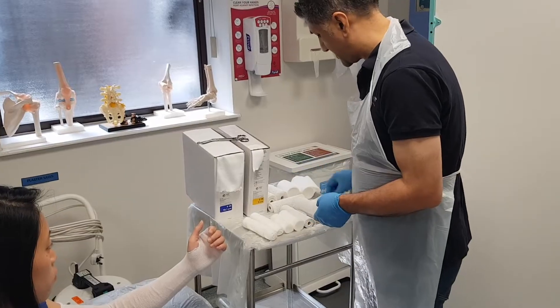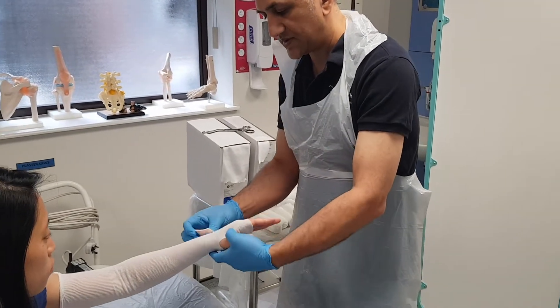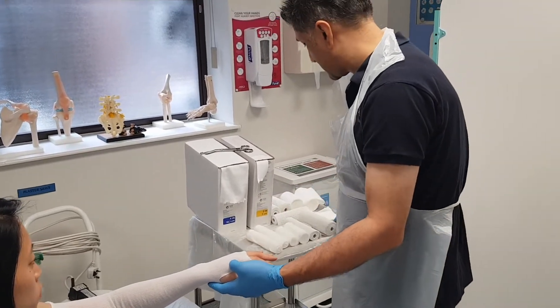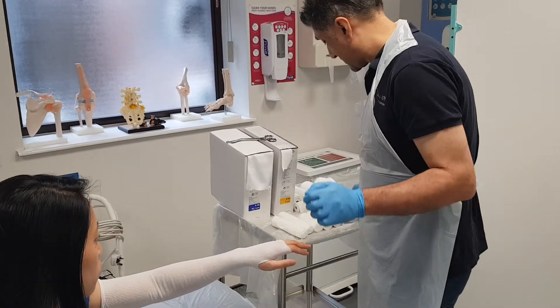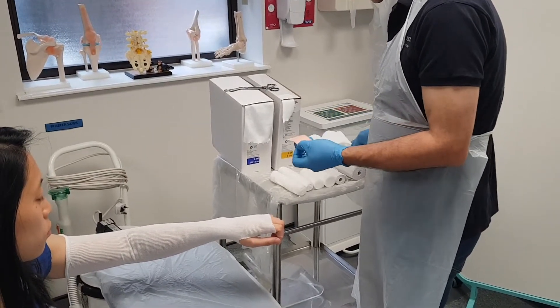Next we're going to apply some felt. We could put the felt over the styloid like that and step this down. If you don't have felt then you could just apply some gauze in order to protect the styloid. I'm going to use the felt today because it's got a sticky back.